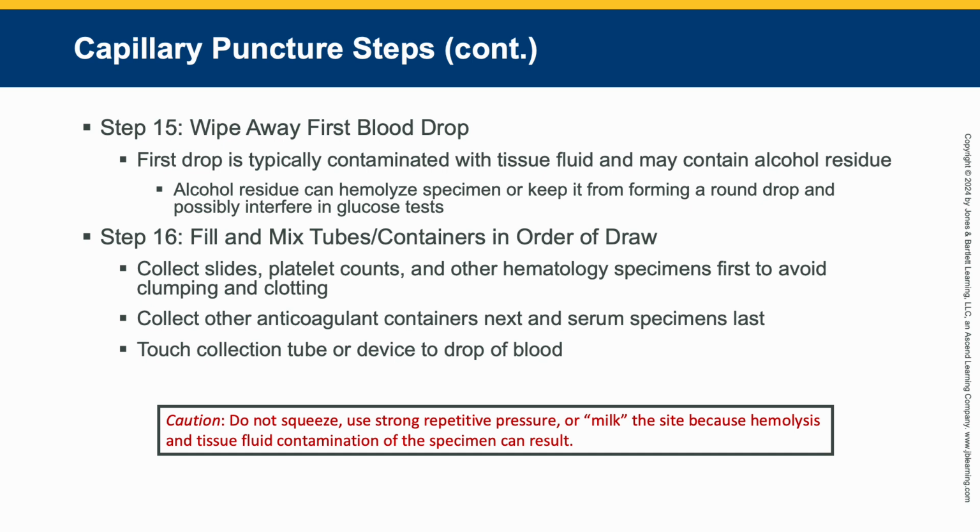Then you are going to start collecting every drop after that. So step 16, fill and mix the tubes. Make sure you're going in the order of draw. Collect the slides if you're doing a slide.